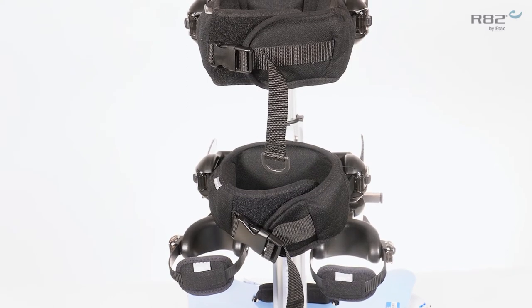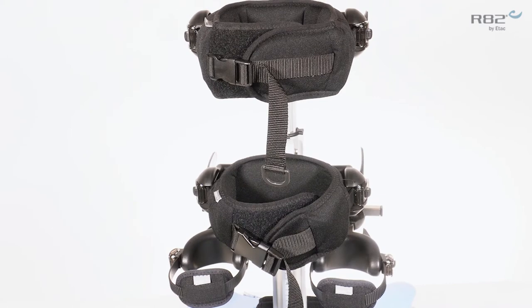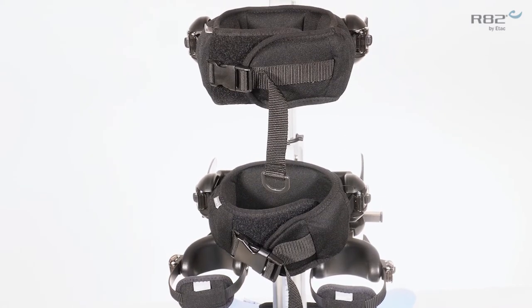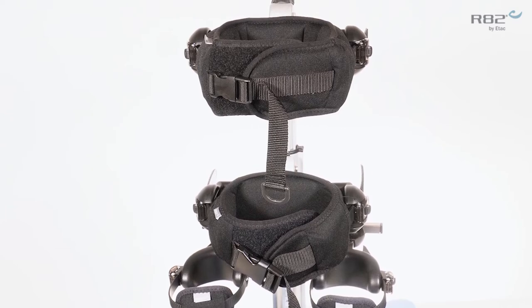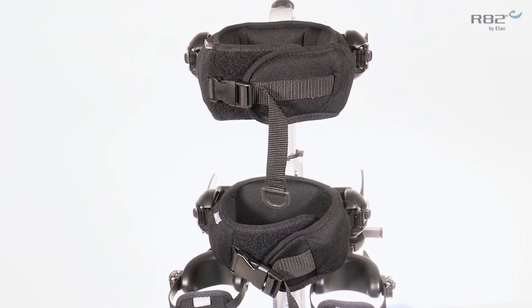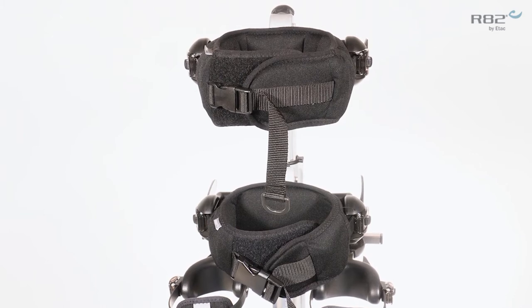The Meerkat has an option for a chest and a pelvic support. Both chest and pelvic supports are offered in four sizes, ranging in a circumference of 17 and three-quarter inches all the way up to the extra large that will accommodate a 43 inch circumference.